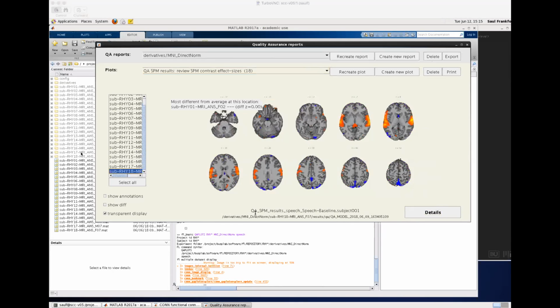Variance because of that. Right, and I'm trying to also incorporate the CompCor strategy into our potential ways of trying to remove these types of things and reduce the potential residual effects of motion and physiological effects in our first level analysis as well. So I'm hoping to have that available soon.